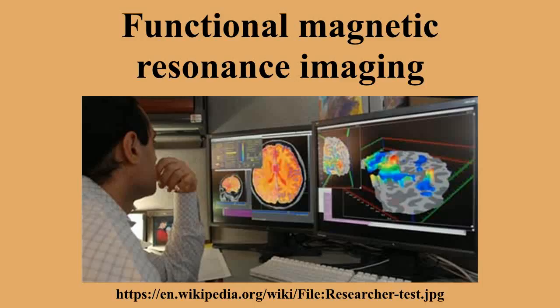Remembering a similar event may take a few seconds, and emotional or physiological changes such as fear arousal may last minutes or hours. Learned changes, such as recognizing faces or scenes, may last days, months, or years. Most fMRI experiments study brain processes lasting a few seconds, with a study conducted over some tens of minutes. Subjects may move their heads during that time, and this head motion needs to be corrected for, so does drift in the baseline signal over time. Boredom and learning may modify both subject behavior and cognitive processes.